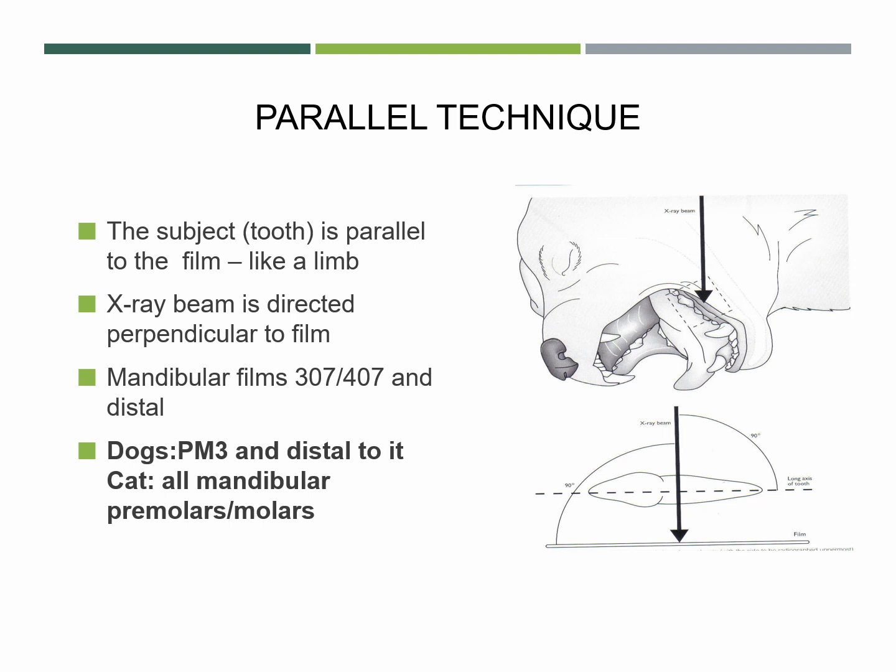Because remember, we do care about the crown of the tooth, but what we really want to see is what's below. And to get a good diagnostic X-ray, we need to have a couple millimeters around all the areas of the tooth to see the pathology that's happening around there. So in this case, we can push that film deep enough into the mandible. Like for 307 and 407 in distal, we can get it deep down.